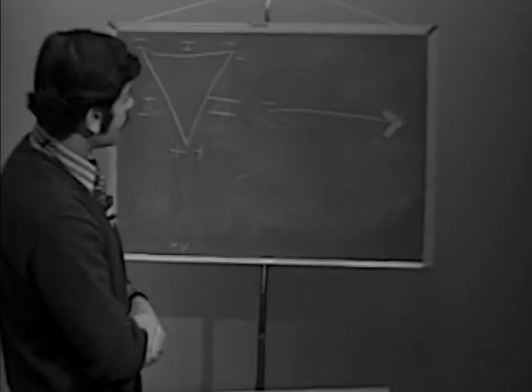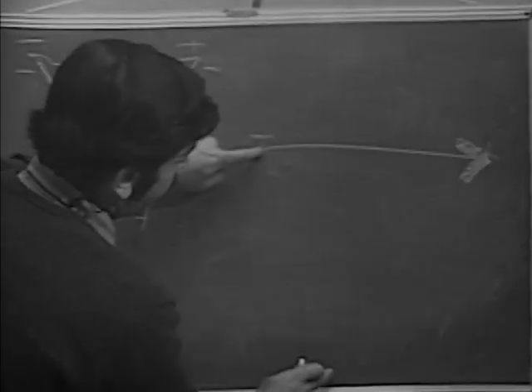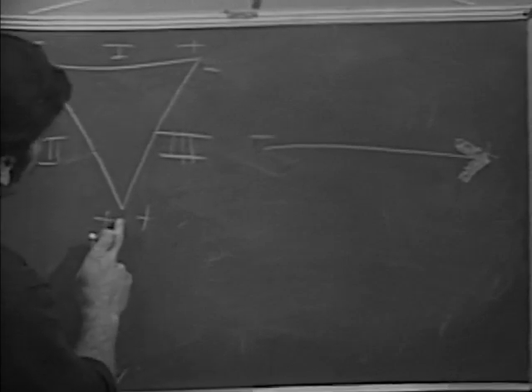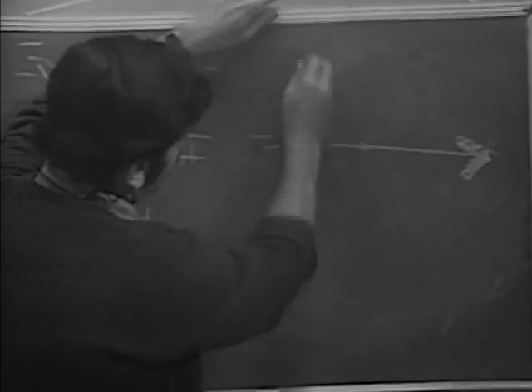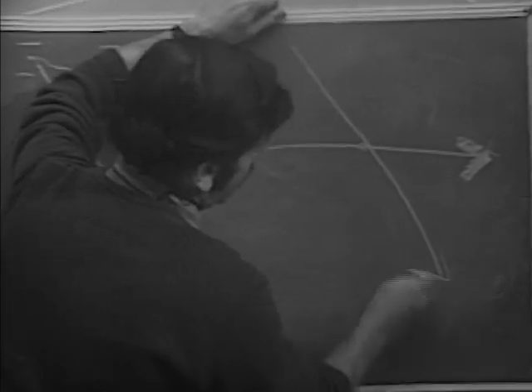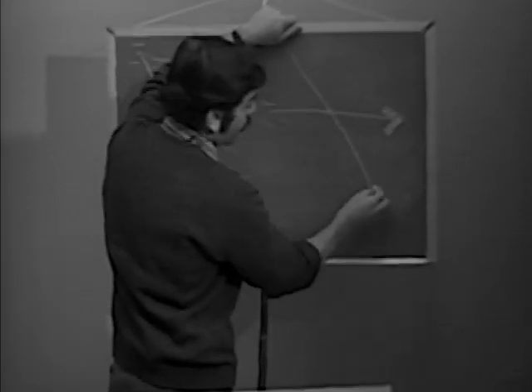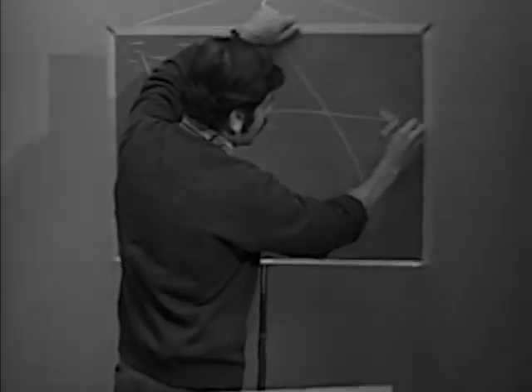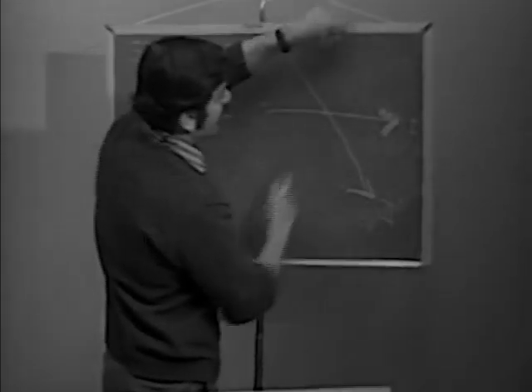Now we'll do the same thing with lead 2, except instead of putting it down here, as this triangle is, we'll run it right through a central point. So we're superimposing them instead of forming a triangle. So this would be lead 2. And then lead 3 would do the same thing.